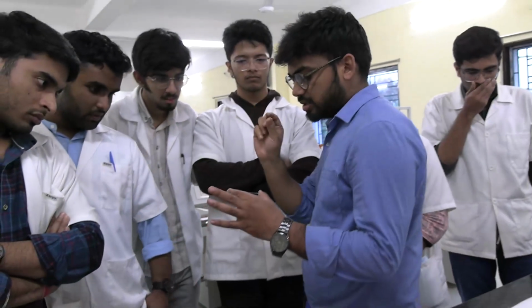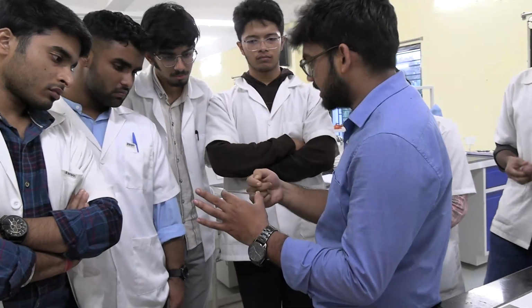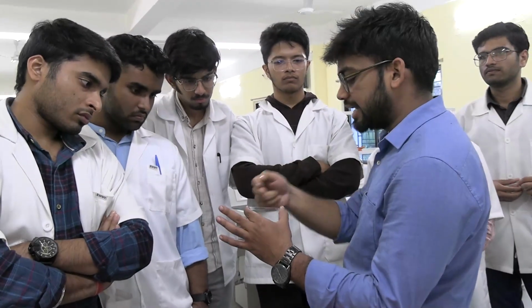Place it where you are going to find this. This is the head and the tail end. At the tail end there are going to be more WBCs. At the head end there will be more RBCs.